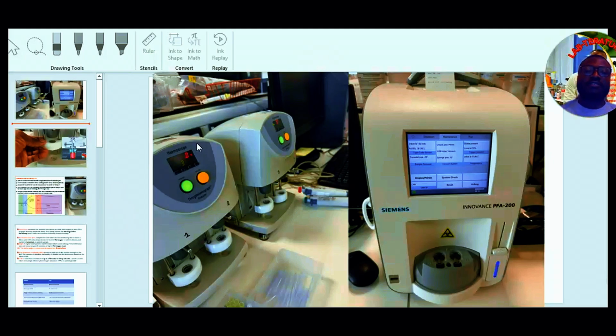Both of them have a very similar principle, and as we go along, I will explain how the differences come about. However, they both give an overall functional picture of clot formation, considering the clotting factors, fibrinogen, platelet amount, and platelet quality, and also give a clue if you are on any treatment that could compromise clot formation. It's used in monitoring people who are undergoing intensive surgical procedures, especially heart surgeries, and if anyone is in a disseminated intravascular coagulopathy.